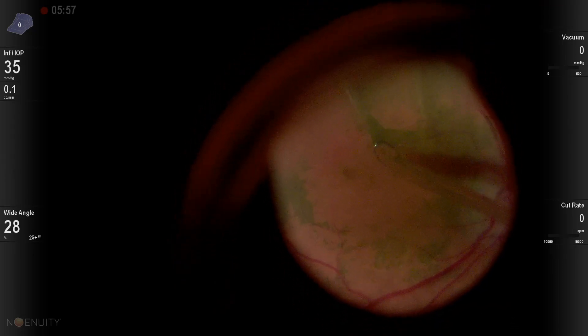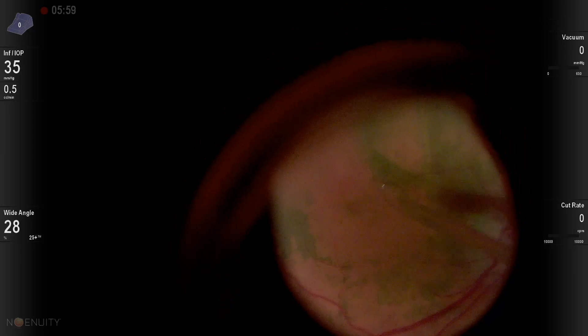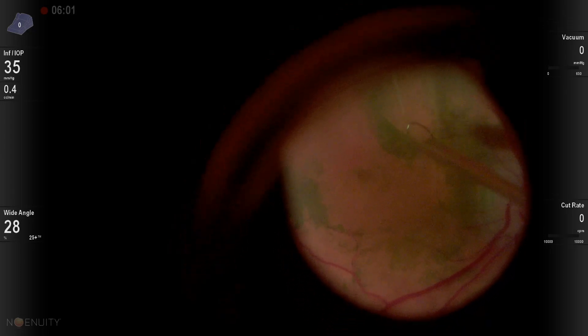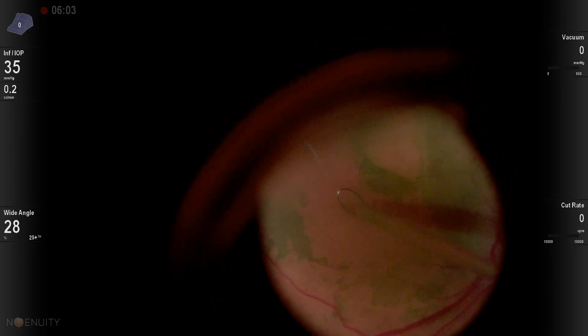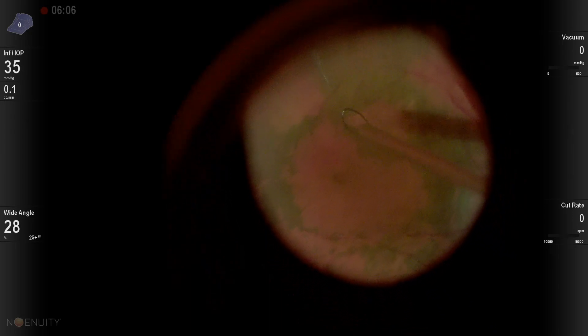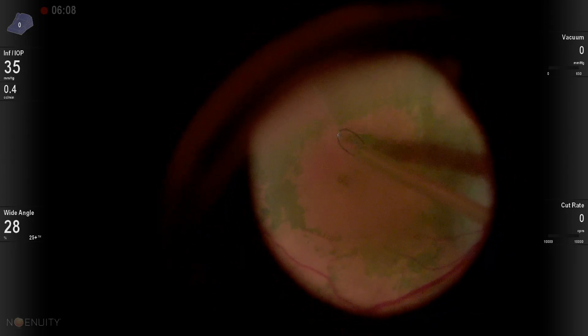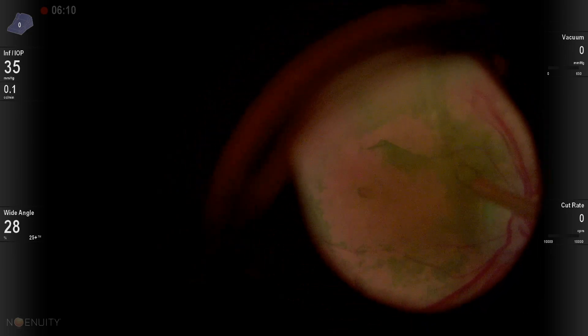You can see this patient is breathing a lot and there's a lot of eye movement, yet the retina never goes out of focus. The Flex Loop is really nice because if you have a patient with a lot of movement, pinching and peeling the ILM or epiretinal membrane can be dangerous.